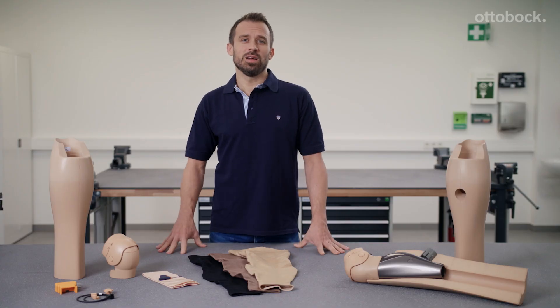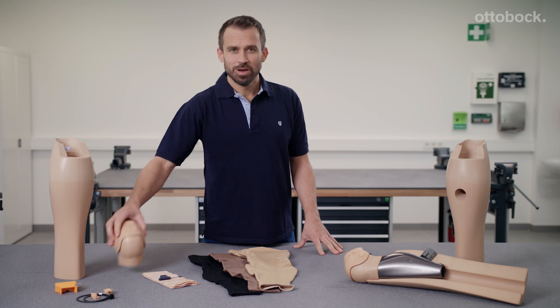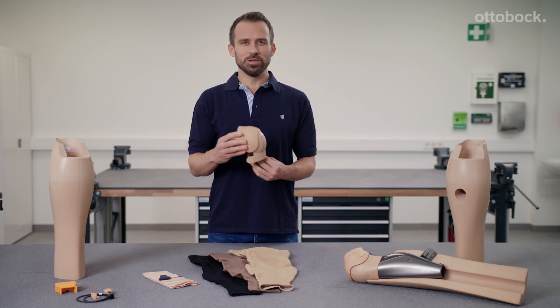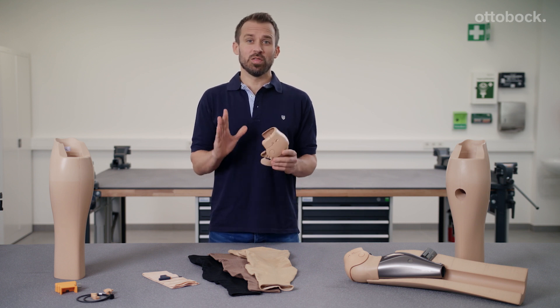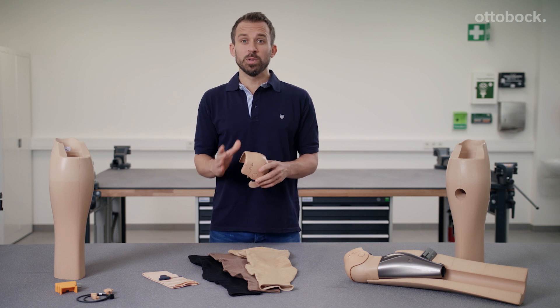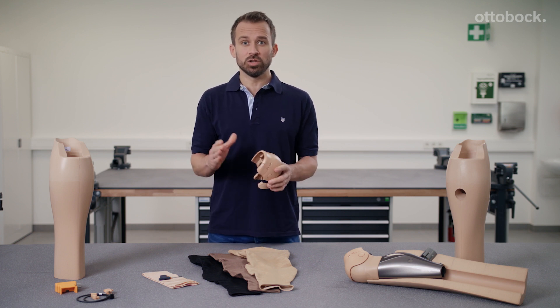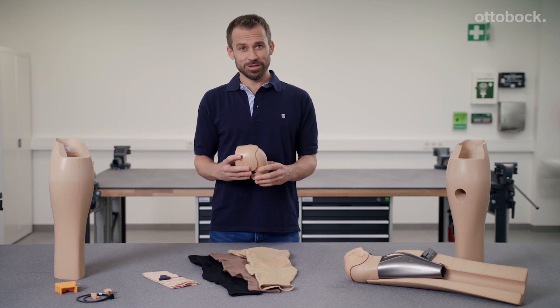The principle behind the functional cosmesis is very simple. Using this functional knee part, a shank like this and this stocking, I am able to fabricate an authentic looking cosmesis with convincing functionality for people who wear the C-Leg 4 and Genome knee joints, which help them lead low profile everyday lives.